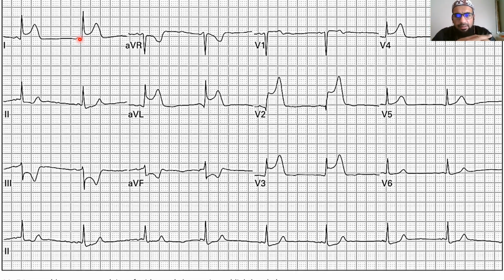I always give the guys the simplified example of narrow and wide QRS complexes. If you were working in my department, here I stand, Dr. Mohammed, head of department, working in emergency department for a few years. You're a student, you're a new doctor or a ComServe doctor. We get a patient with an ECG.